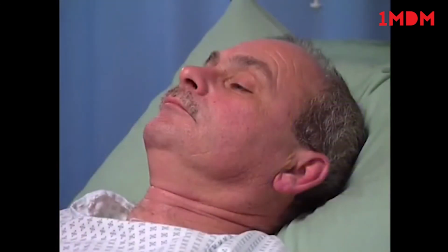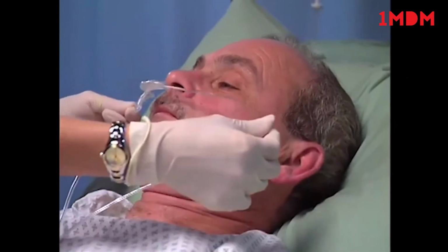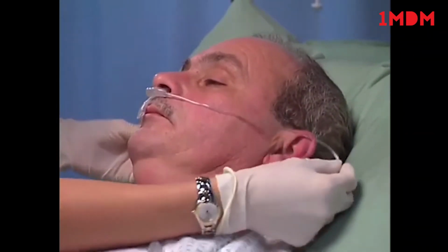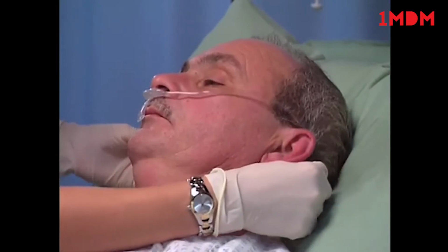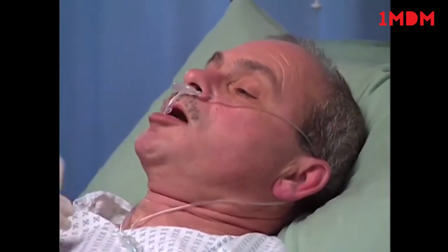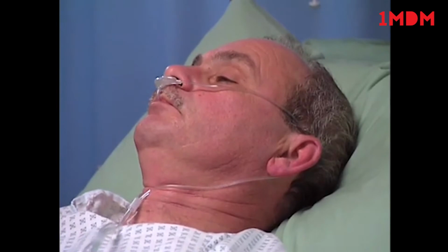When using the nasal filter line, check that both nostrils are clear. Position the nasal filter line on the face by inserting the filter line tips into the nostrils. Pass the filter line tubing over the ears. Slide the sleeve up the tubing towards the neck for a comfortable fit under the chin. Check the positioning of the filter line to ensure proper detection during monitoring.